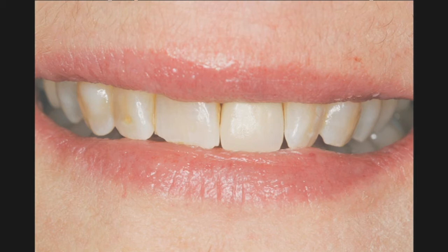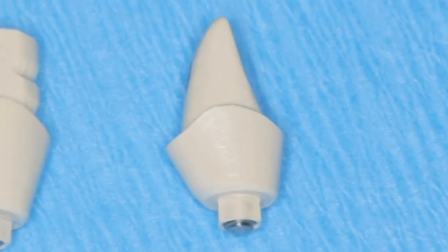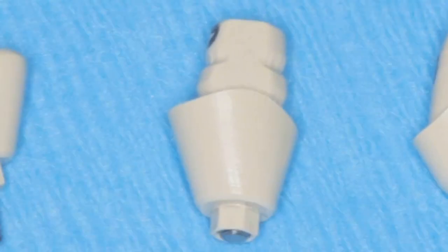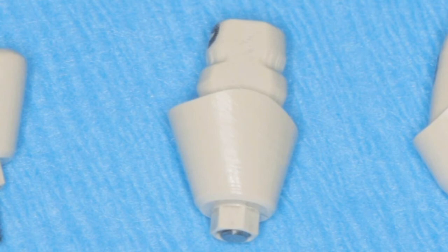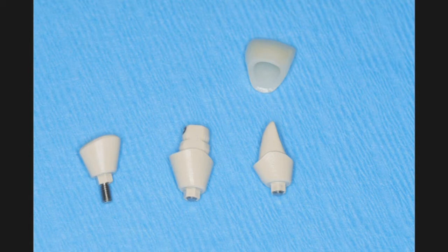After it heals, we can still use the custom milled transitional or temporary abutment to eventually place that biotemp while the lab is finalizing the final zirconia crowns. And we can also use the custom milled transitional impression copings. Again, we're trying to establish our contours of our tissue, which makes the job of the laboratory technician that much easier. So a striking feature of the inclusive tooth replacement solution is that it allows for substantial treatment versatility while enabling excellent soft tissue contouring regardless of the choices made.